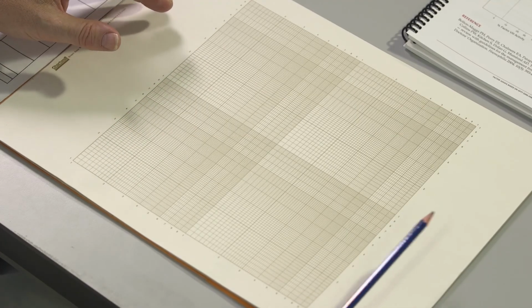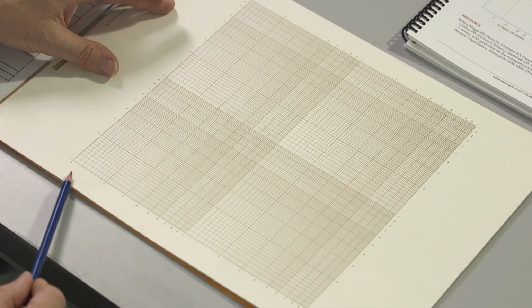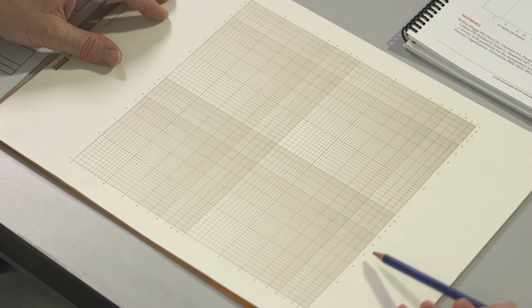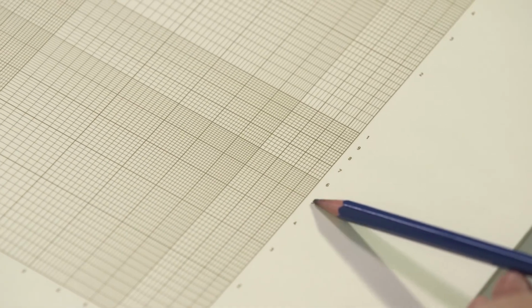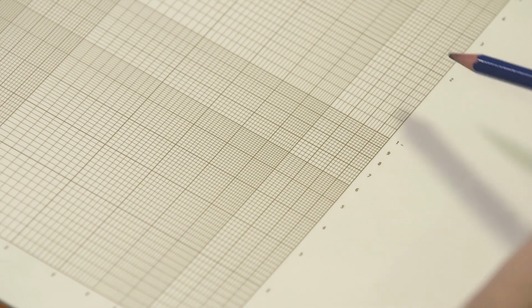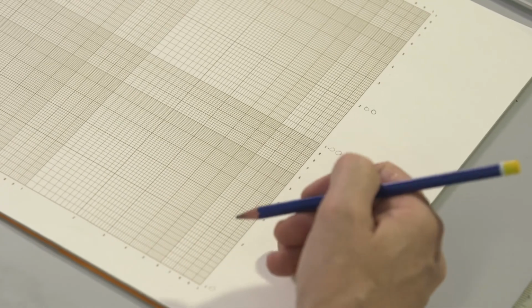So we're working on a double logarithmic scale. We plot the concentration of factor VIII along the x-axis, the clotting time in seconds on the y-axis. If we decide the first one is 10 seconds, these become 20, 30, 40, 50, 60, 70, 80, 90, 100 seconds, 200, 300, 400. So 10 seconds, 100 seconds, 200 seconds. Plotting time.